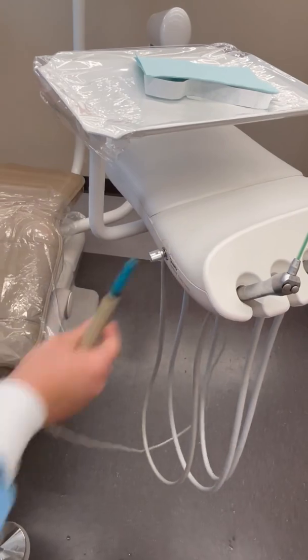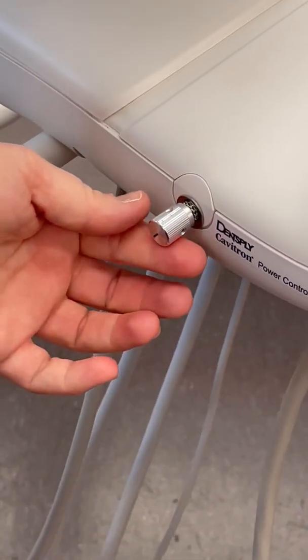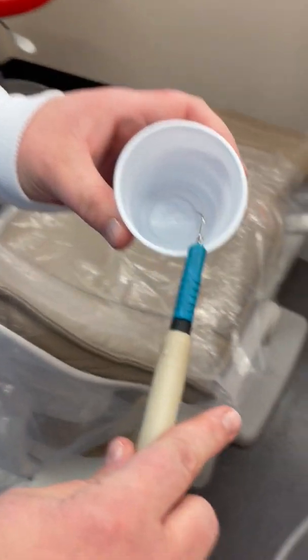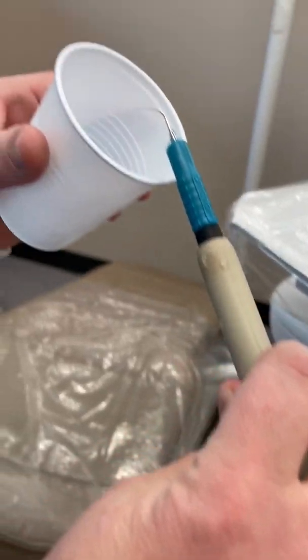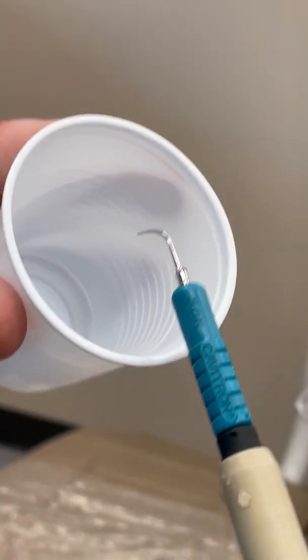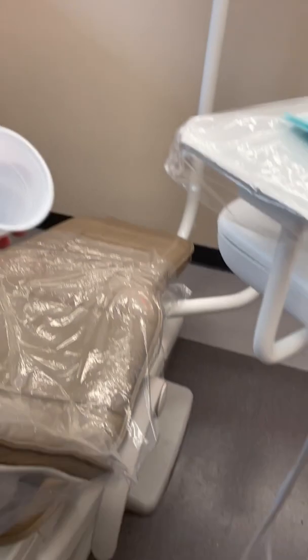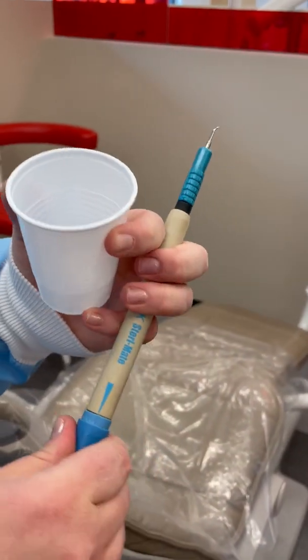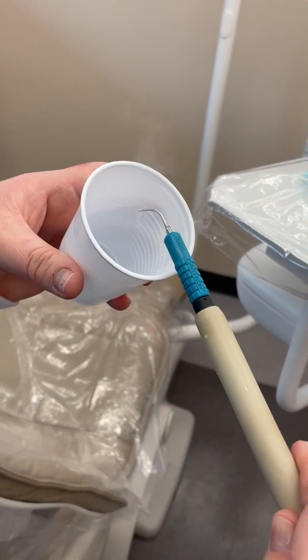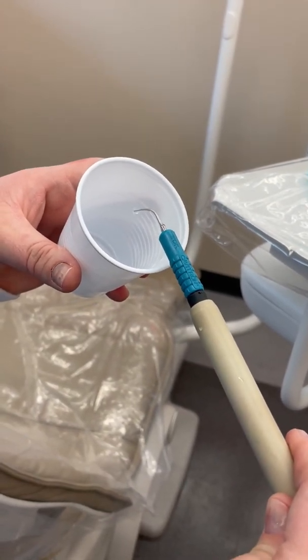I'm going to turn the power a quarter turn — so that's all the way down, quarter turn. I'm going to turn the water up a little bit. You see that drip? It's just about perfect.